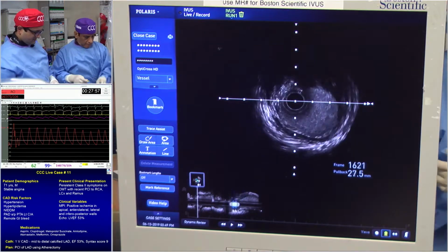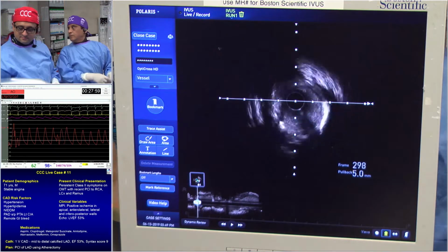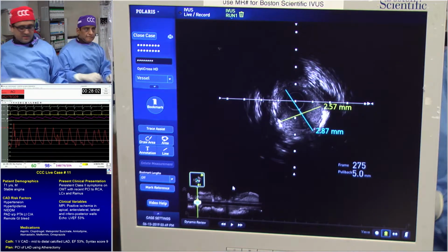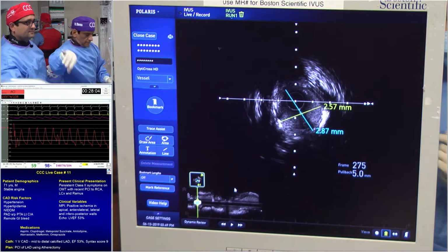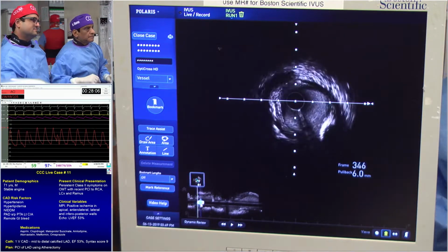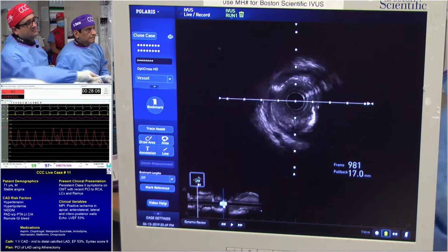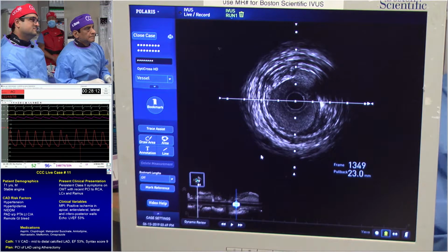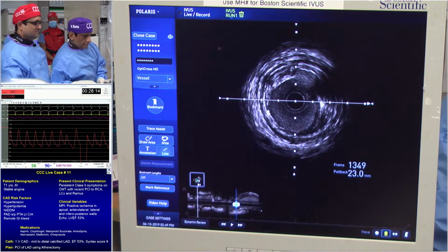The fact of the matter is the ruptured plaque is a problem because it's thrombogenic. But if the thrombogenicity is out of the plaque, and what you have is a crater, that is, for me, harmless. Most importantly, when you do ACS, STEMI, OCT, you see these, and the stenosis is about 3 millimeters distal.